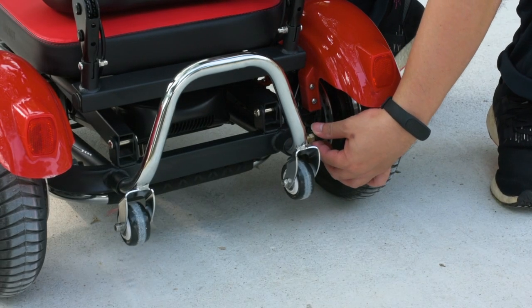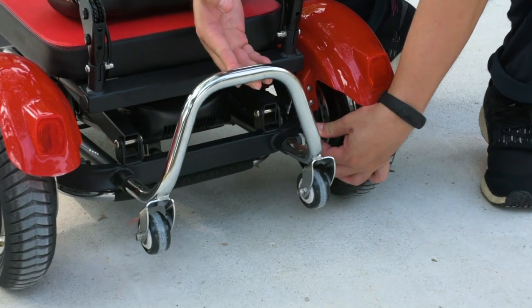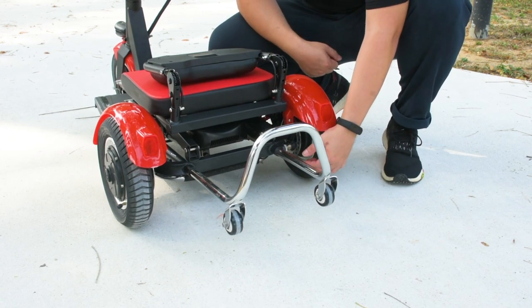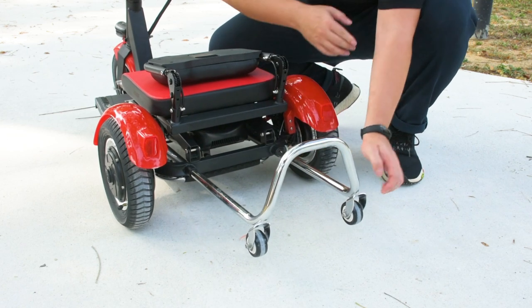The rail at the back can be pulled out by unhooking the latch and pulling the rail out to the second stop, then hooking the latch back in place. With the rail pulled out, it serves as a convenient place to put a basket or bulky items like boxes. Remember to retract the rail when not in use.